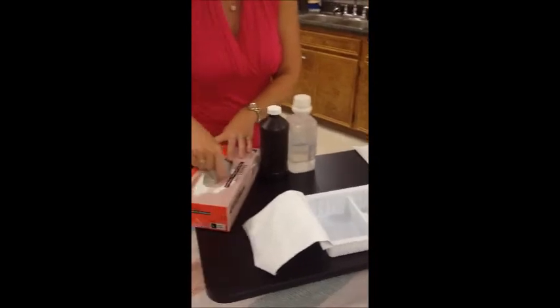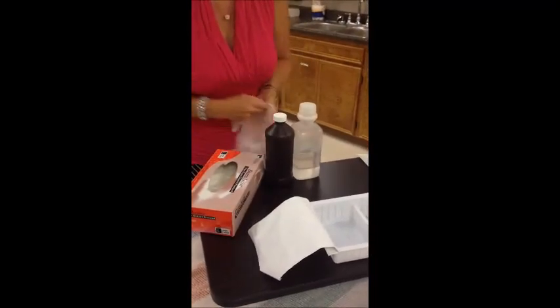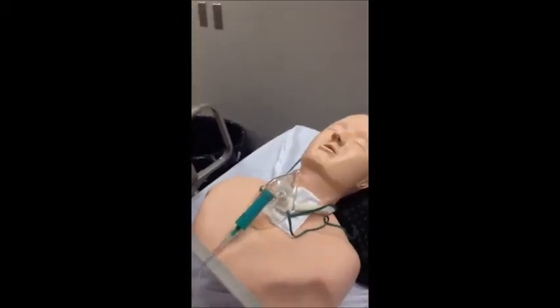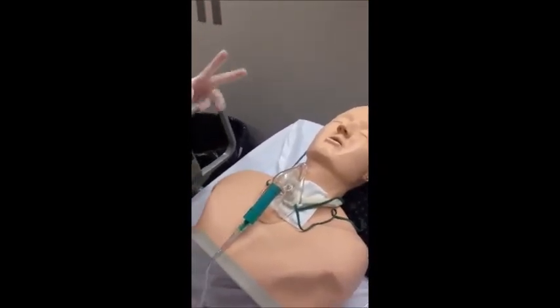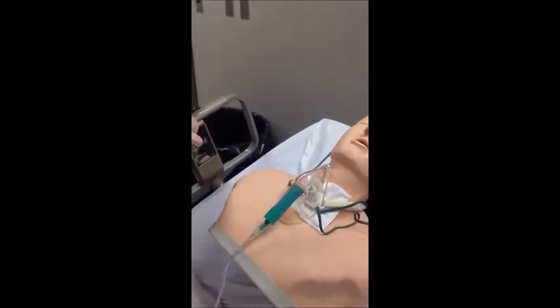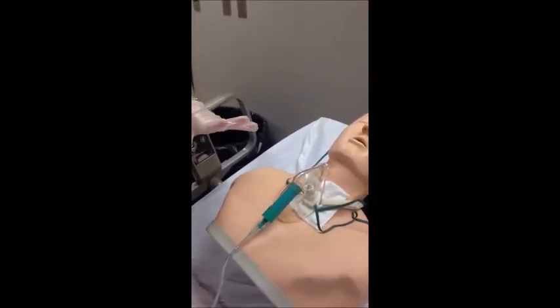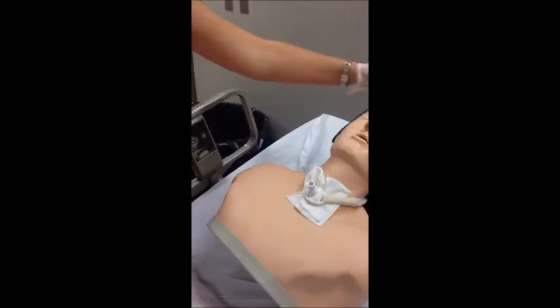Now you're going to get you some clean gloves. You're going to come over. Patient's oxygen does not have to be really high on this one because we're going to be replacing the O2 source and we're not suctioning. So we do want to replace the oxygen though every time we remove it. So I'm going to take the oxygen off.